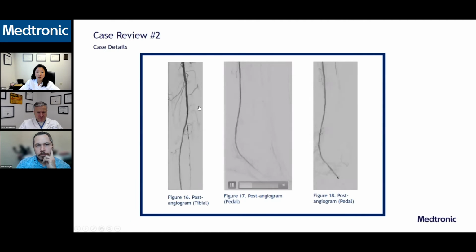And this was her angiogram after. You can see the area of the dissection looks much better. And then into the foot, there's a patent pedal arch filling into the dorsalis pedis as well.